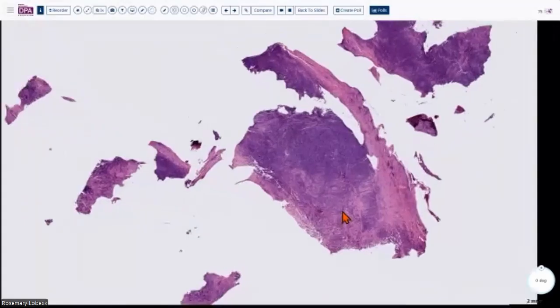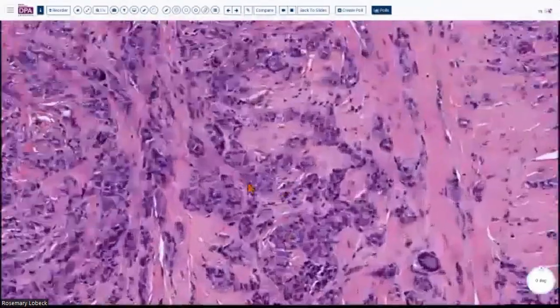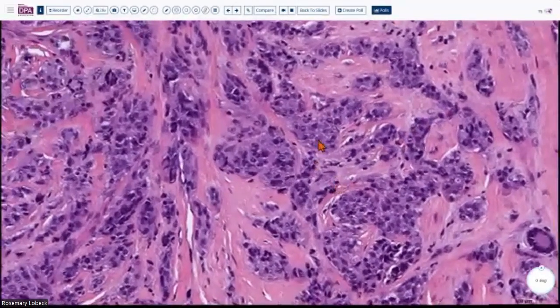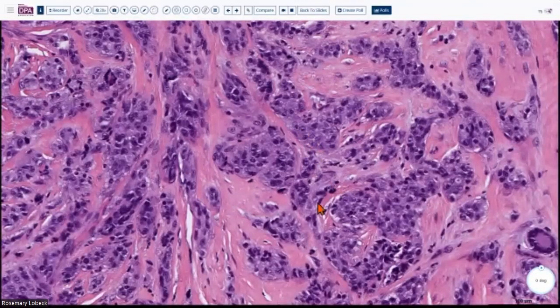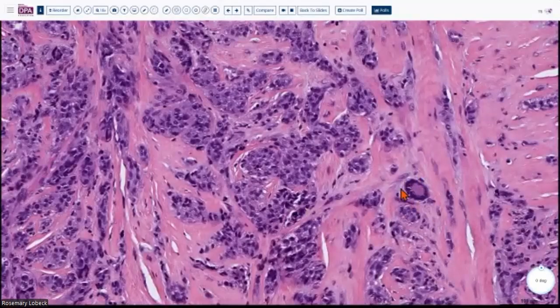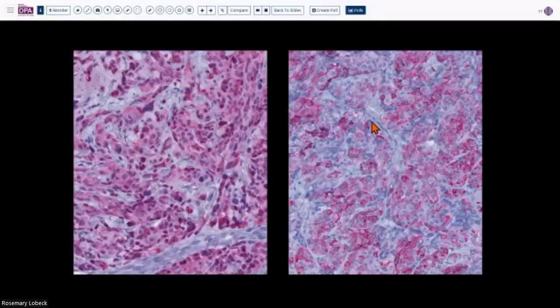So you look at the biopsy on this one, and you zoom in, you will see that this is a nest of epithelioid cells, several nests and some cords of epithelioid cells, right? And then you also have some of the cells having more prominent nucleoli. And then a peculiar feature is that you find these giant cells in this particular lesion. And I want to show a similar case, or before that, we have some immunostains. So this is S100, strongly diffusely positive. This is HMB45, strongly diffusely positive. And Melan-A also showed the same thing. So you know what this is, right?